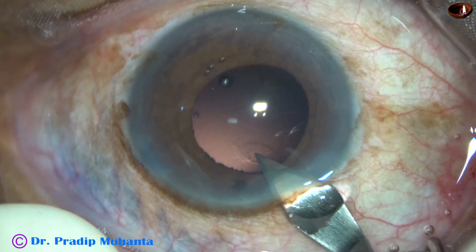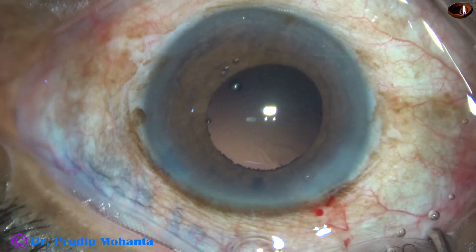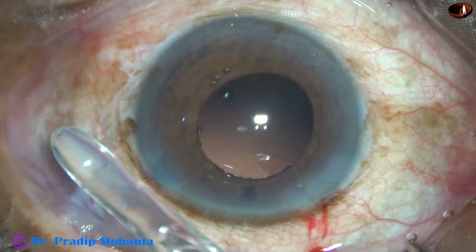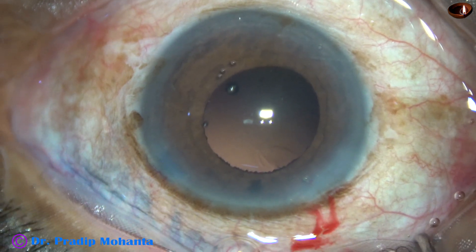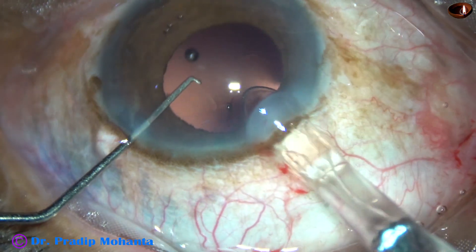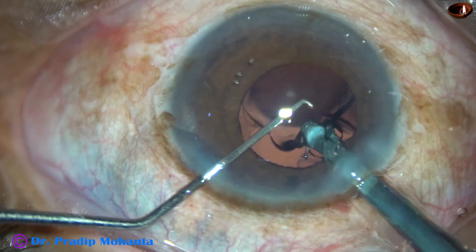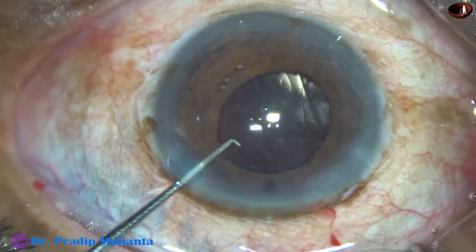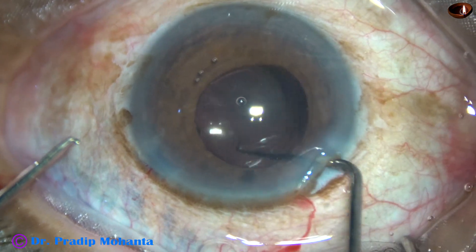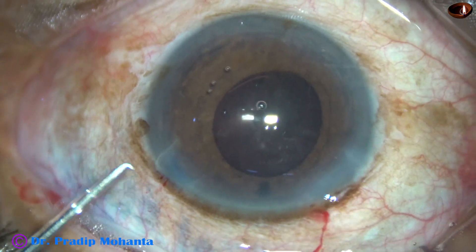I am going to use a Whitstar cartridge. So I enlarge the main wound by about 0.2 mm — size of the wound is about 3 mm now. Here goes the intraocular lens. This is a hydrophilic acrylic single-piece monofocal intraocular lens. Check the lens is in the bag.